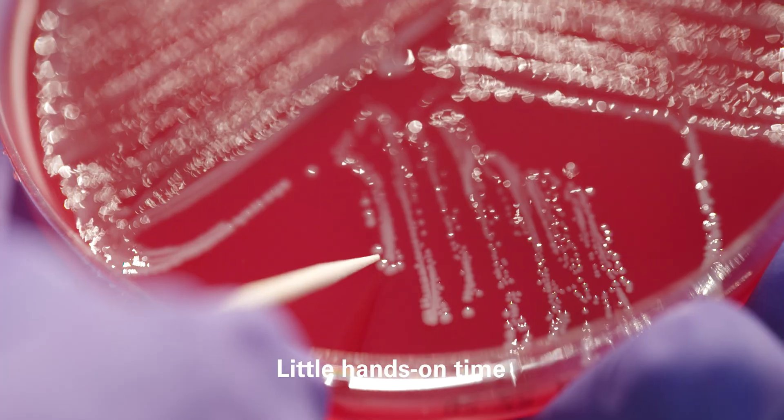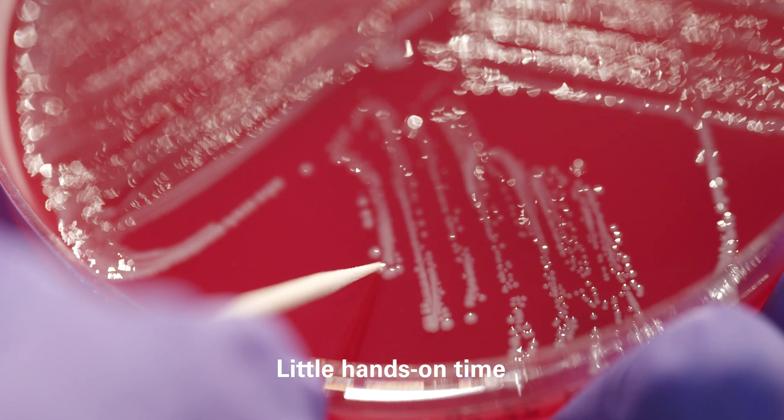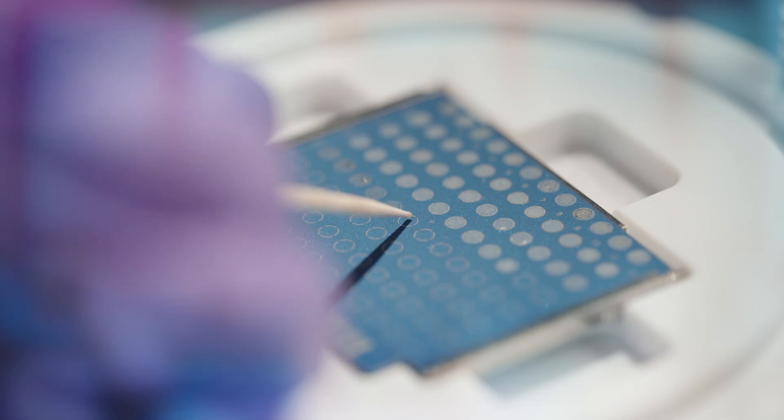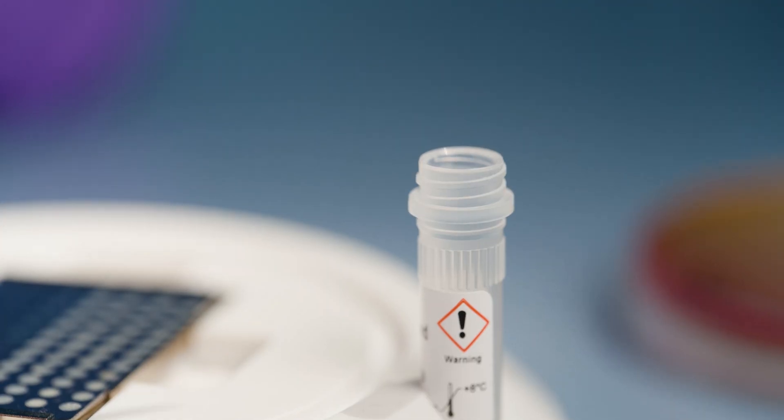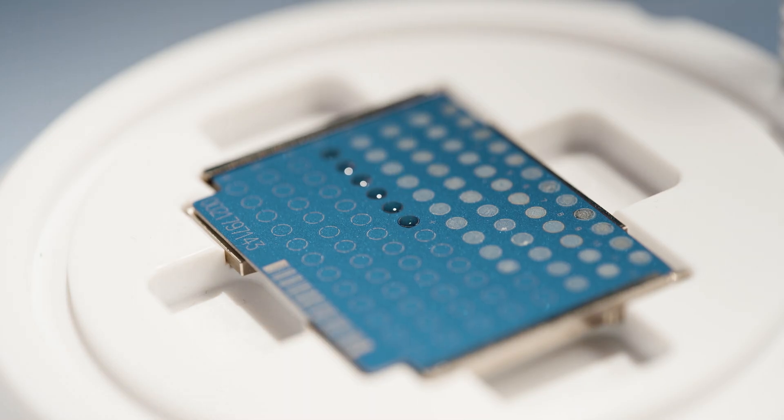After a short and simple sample preparation that starts from a culture, identification results become available in minutes.